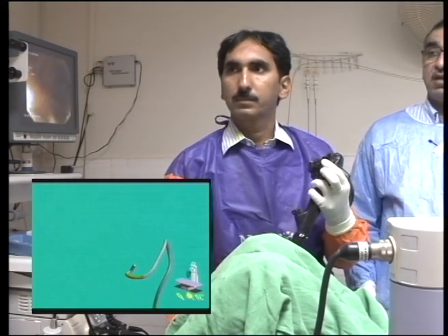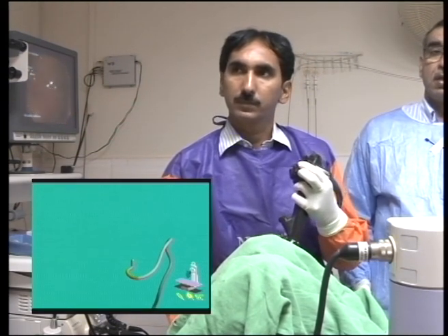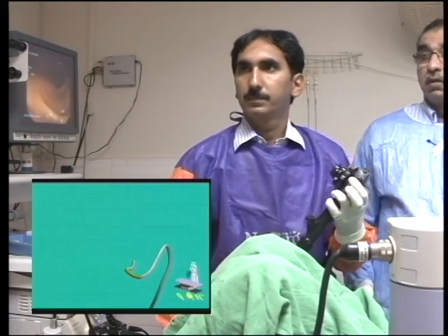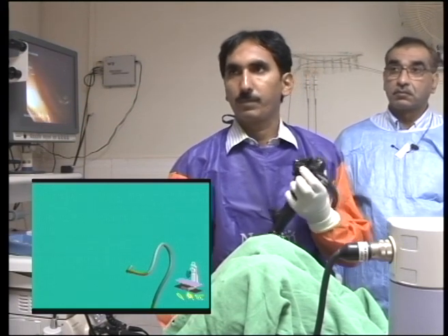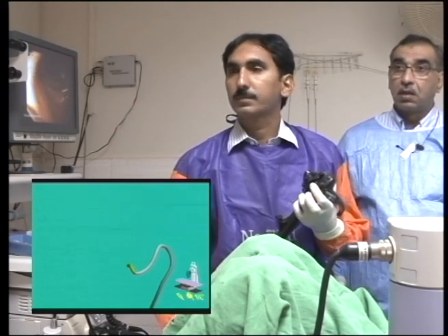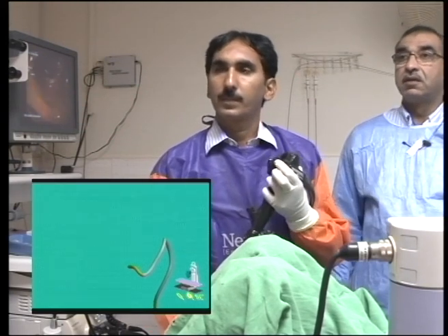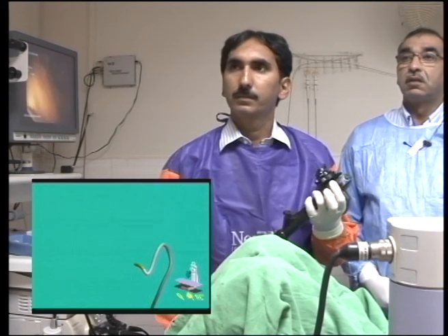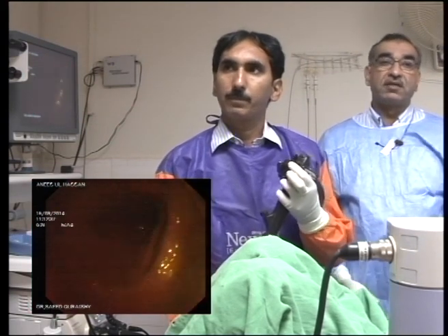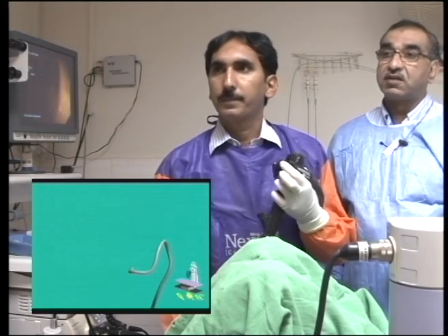Yes, go ahead. You can still go. The gray area tells you that the scope is... No, you are losing your ground, so it means you don't have enough torque on the scope. You can go back again. Go back in. Right? Keep going. Now if you look at the scope guide, it's got a slightly mobile splenic flexure, which is making life a bit difficult, but it's okay. You can still advance.